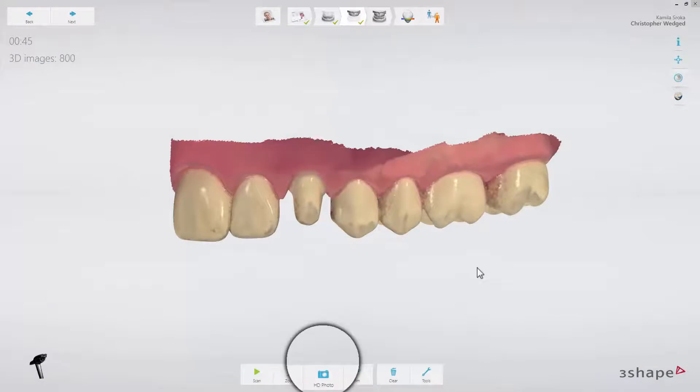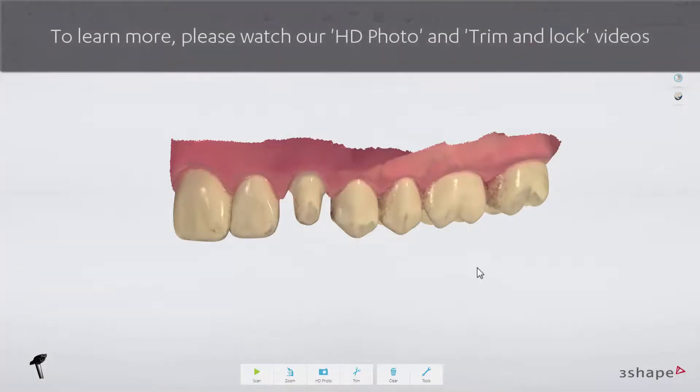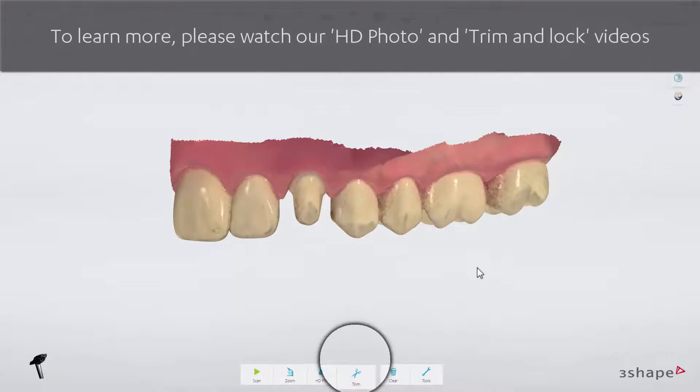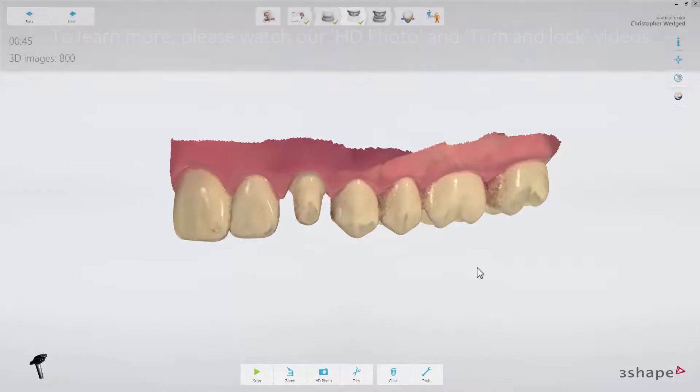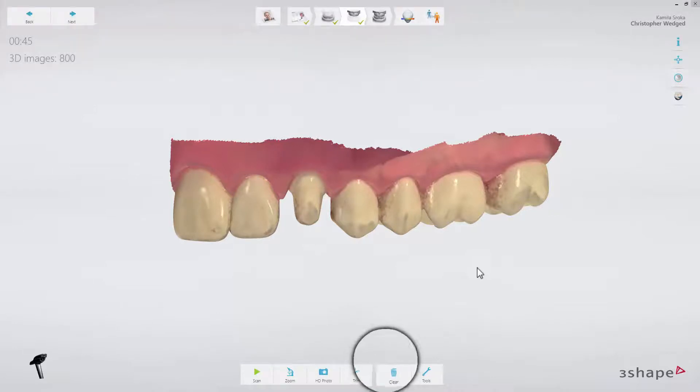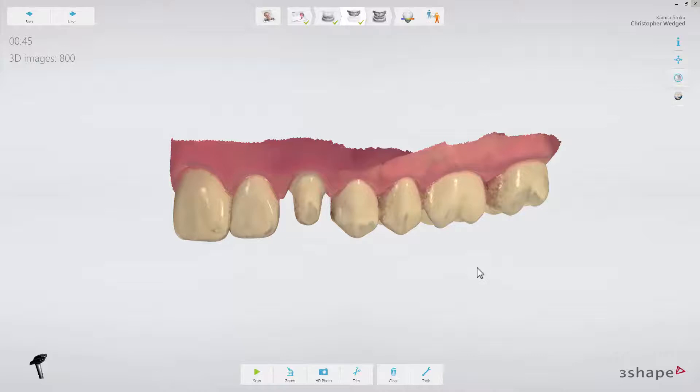HD photo, which you can learn more about in the HD photo video. Trim, which you can learn more about in the trim and lock video. Next to this is Clear, which can be used to remove an existing scan on the active page. It won't delete any of the other scans or details from the other workflow steps.